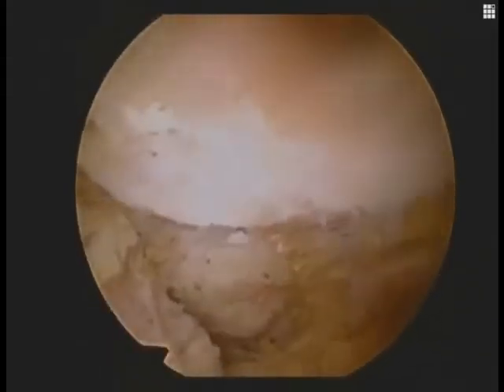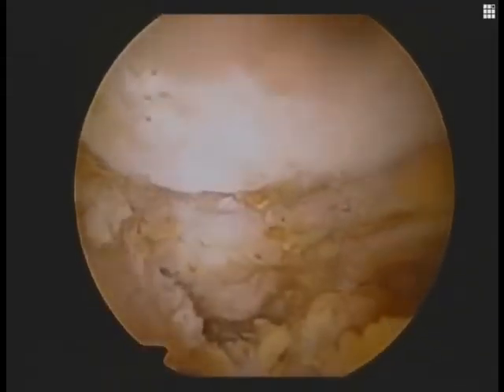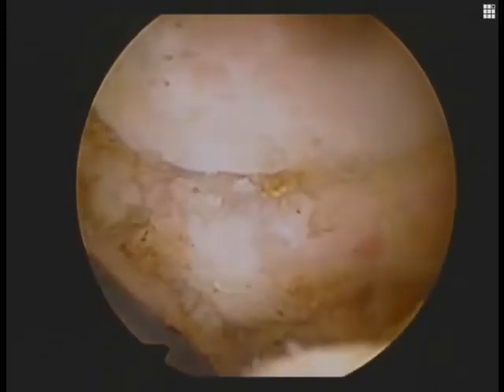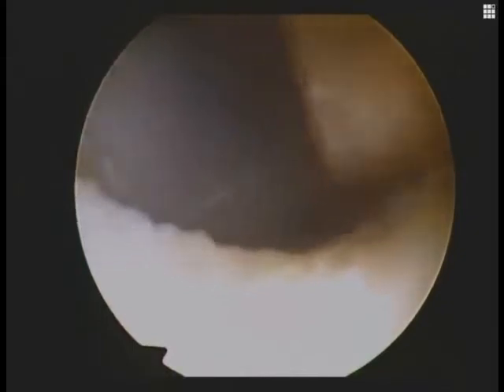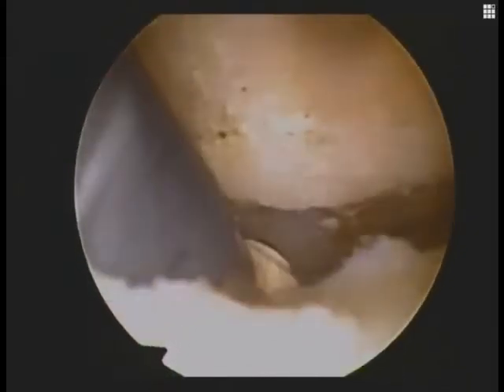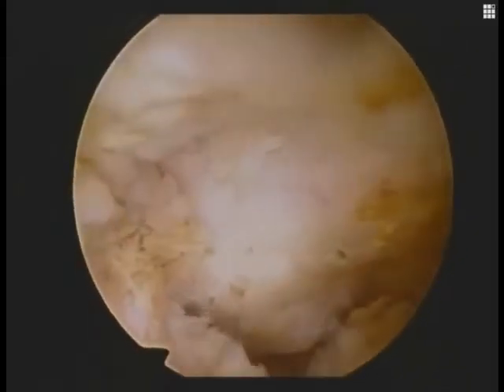We're using the posterior border of the CA ligament as our guide down to the tip of the coracoid. We're debriding our distal clavicle, here seen manually reduced in the foreground, cleaning off the bursal tissue medially in the capsule inferior to the old acromioclavicular joint.